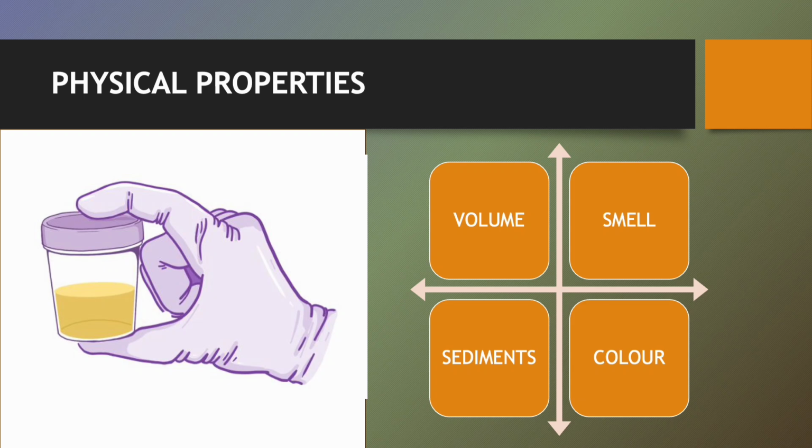Check for deposits in the urine, which are called sediments. And also while you are lifting your glass up, you will sense the smell of the urine.